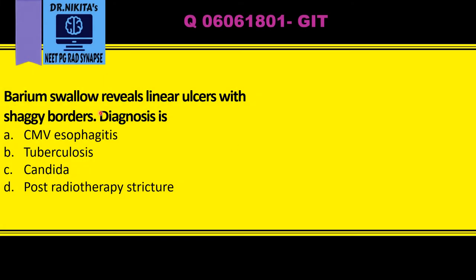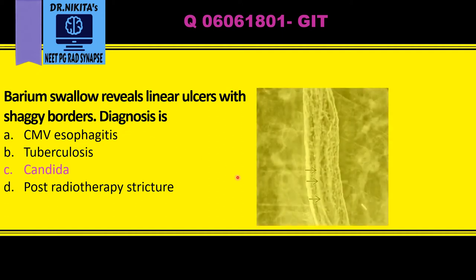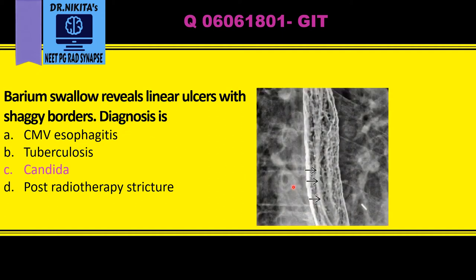Barium swallow reveals linear ulcers with shaggy borders — the diagnosis is candida esophagitis. Candida esophagitis shows longitudinal filling defects caused by plaques, which are the mucosal lesions. These black areas are the plaques, oriented along the axis of the esophagus — that is, longitudinal plaques.